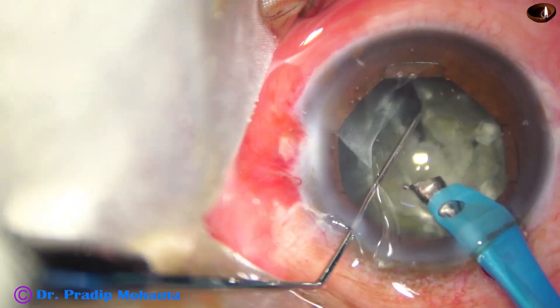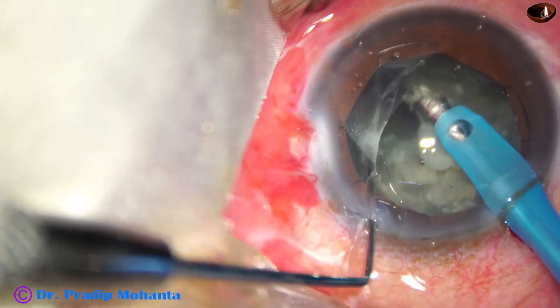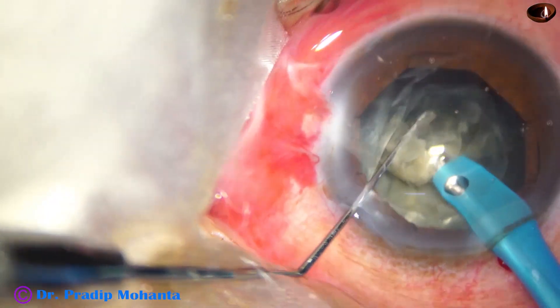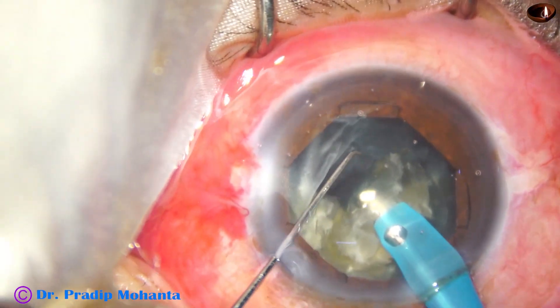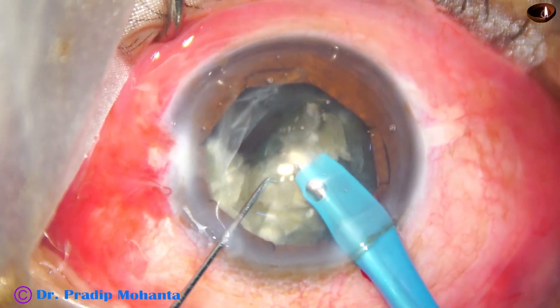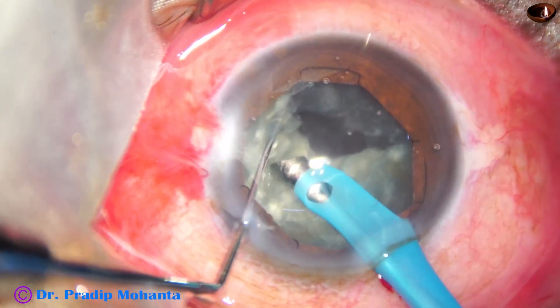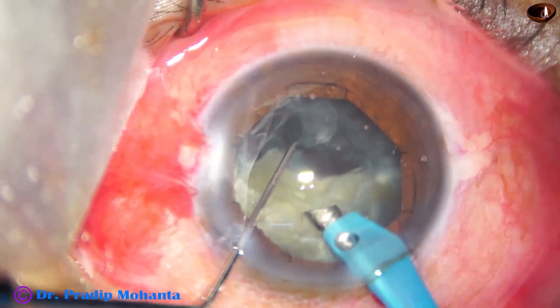I have got a free nuclear fragment. I rotate and want to get as many free pieces as possible — getting another crack. This is the endonucleus; I am removing the endonucleus, and the free nuclear fragment also comes out. The posterior capsule has to be handled very gently. In such cases, there is trampolining of the posterior capsule — it comes upward and goes backward frequently — so we have to be very cautious about that.